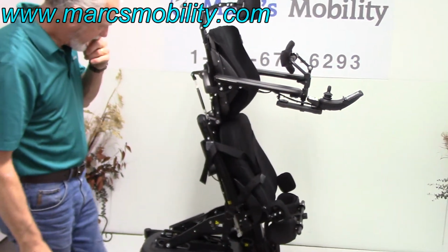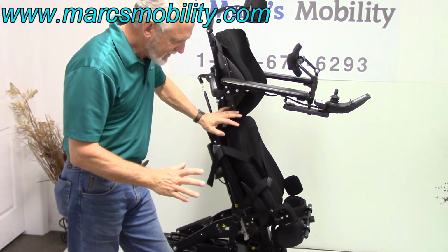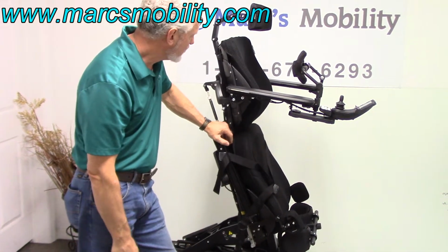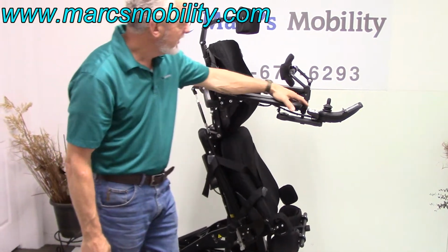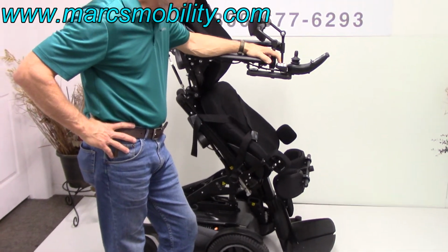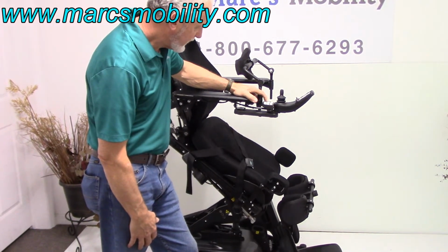So this is your standing feature for inside the house. Now I would probably not go outside. You can stand if you're outside, but I would not be driving outside with a standing feature. I mean, you could, but at your own risk. There's a lot of sensors on these chairs. It's just a fantastic feature to have if you need to be standing because you need to have bone density or you need to have circulation.